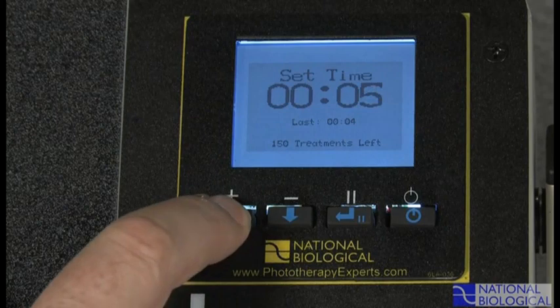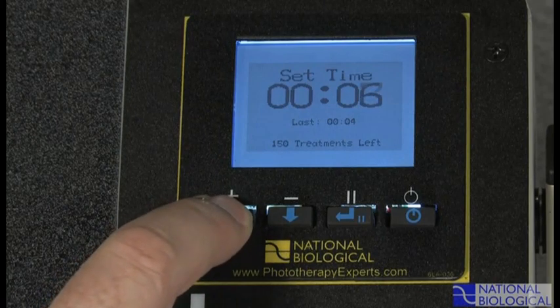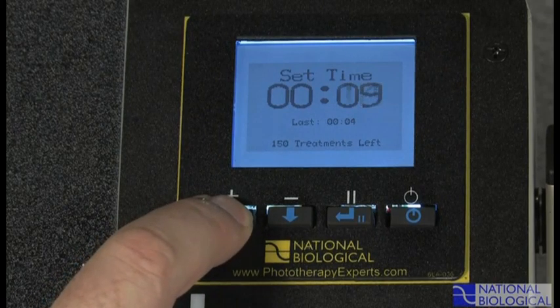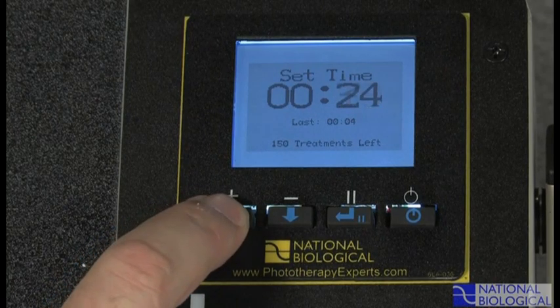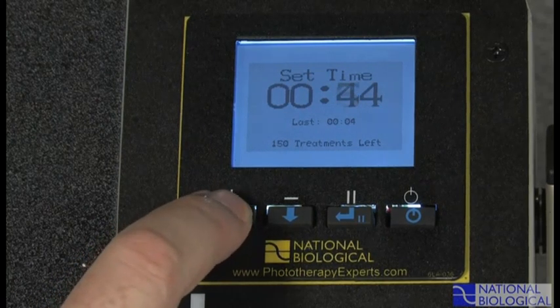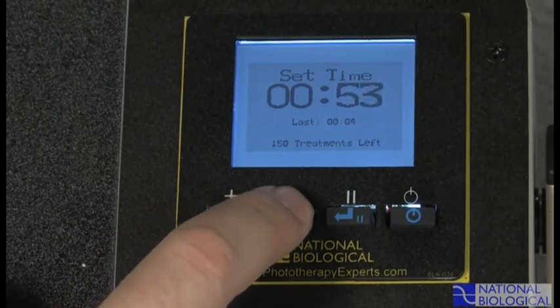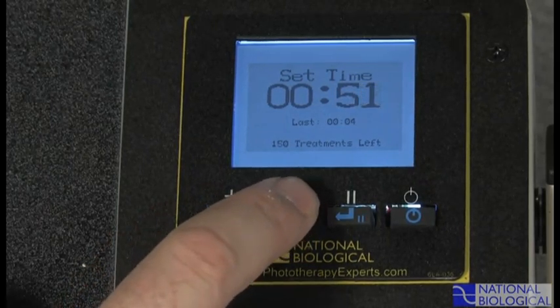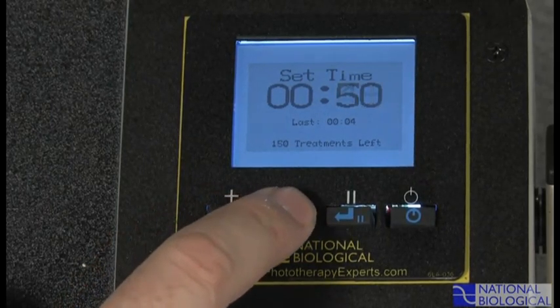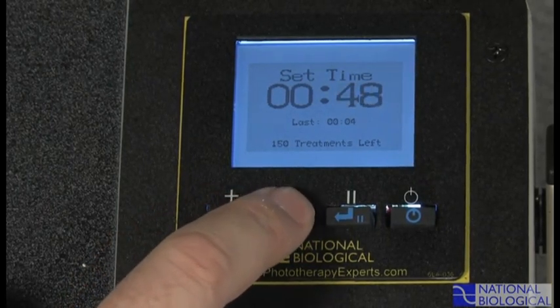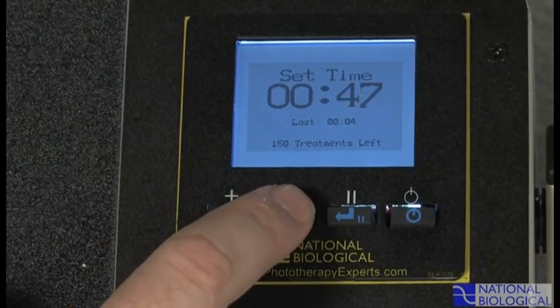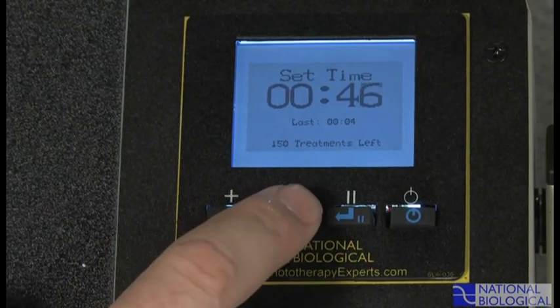Use the up and down buttons to select the precise time prescribed. By pressing once, time changes in one second increments. The longer a button is held, the faster the time will change.